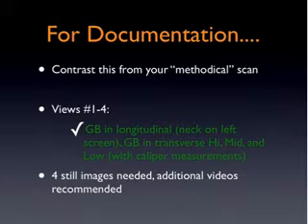This will be in addition to a transverse of the liver as well as a measurement of the common bile duct. Now, I'll always recommend additional videos of both the gallbladder in longitudinal and the gallbladder in transverse that document a thorough comprehensive scan.